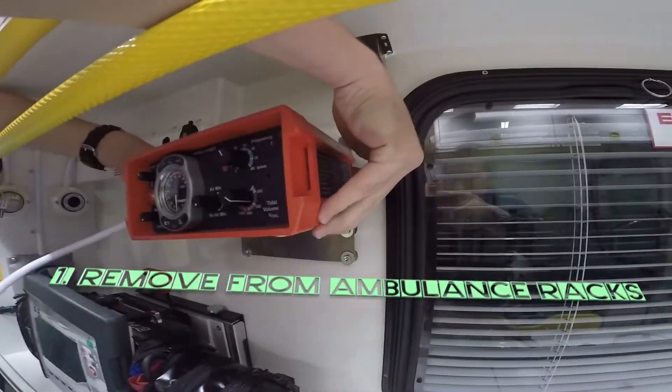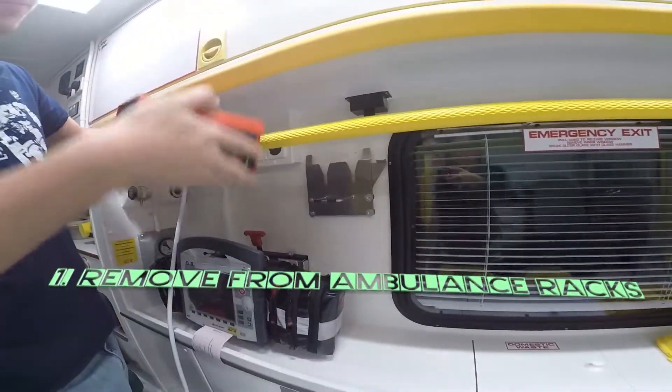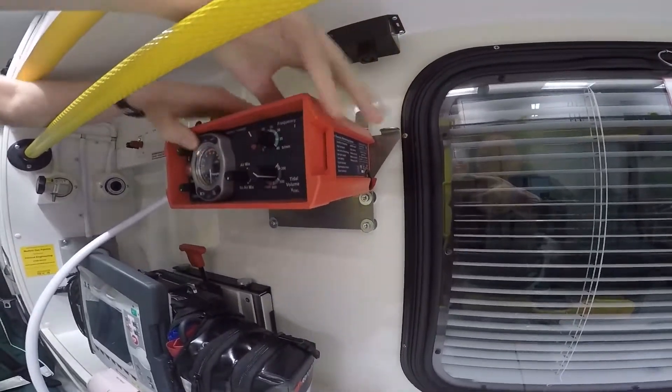To remove the ventilator from the racks, pull the flap to the side and push the ventilator up. To put it back in, simply push it down and pull the flap to the side again.